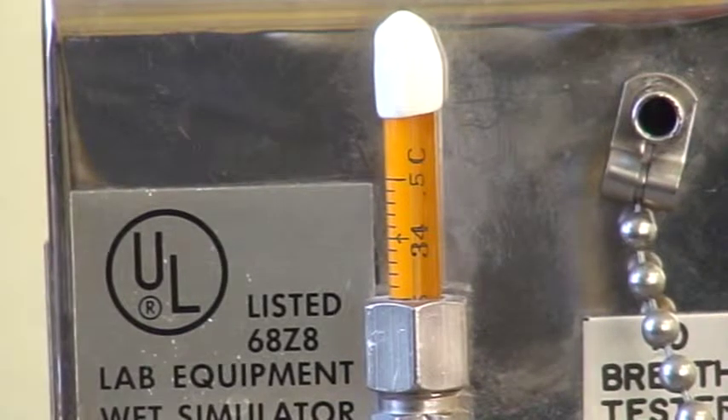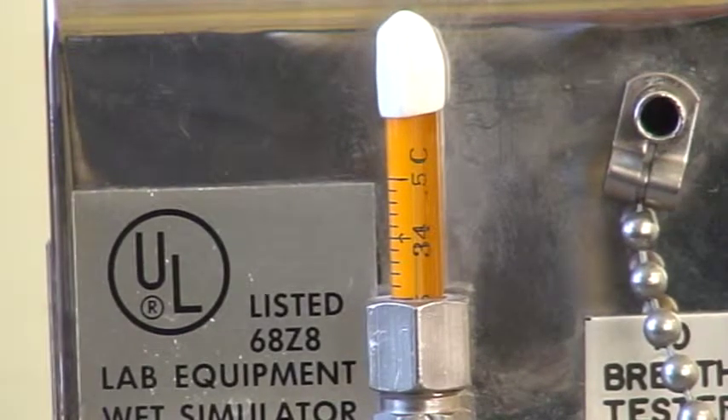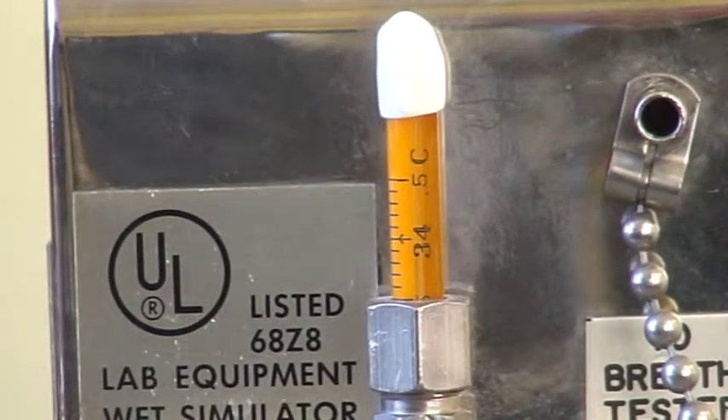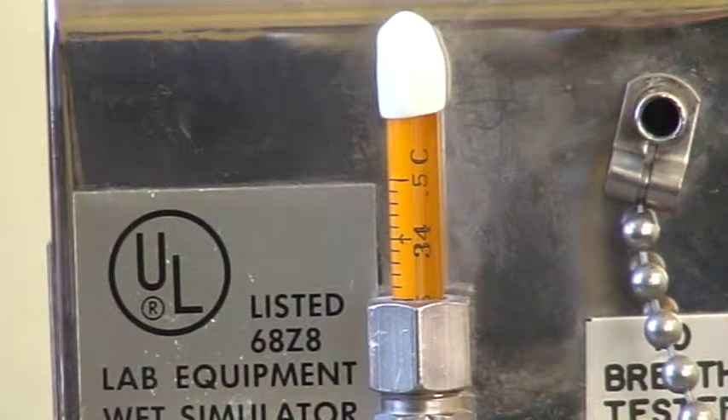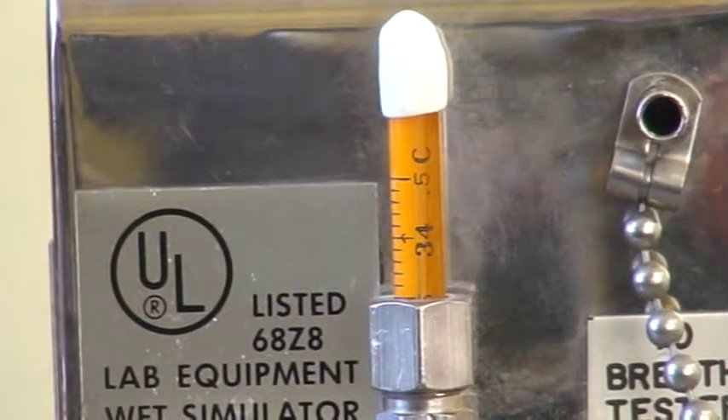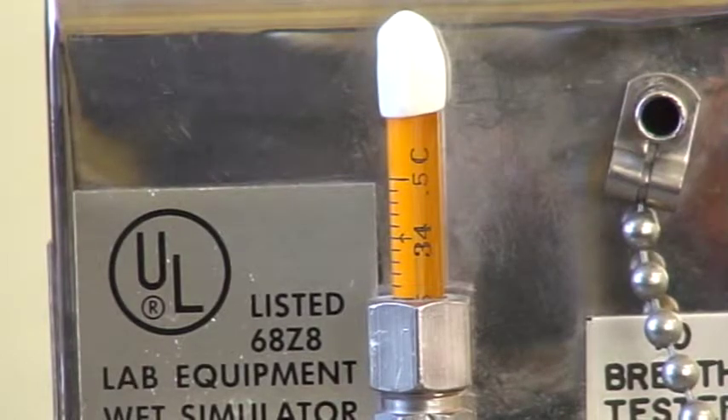The first simulator we're going to look at is a Guth 34C simulator. You can just see the range between 33.5 and 34.5 degrees Celsius. As I look at the camera, it's pretty hard to see where the mercury is in that picture, even with the camera zoomed up like this.